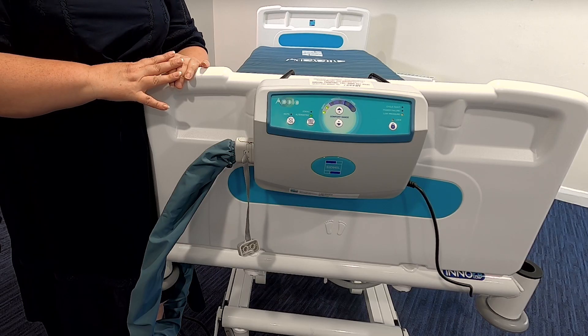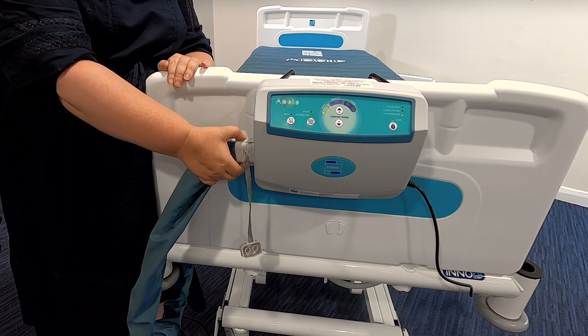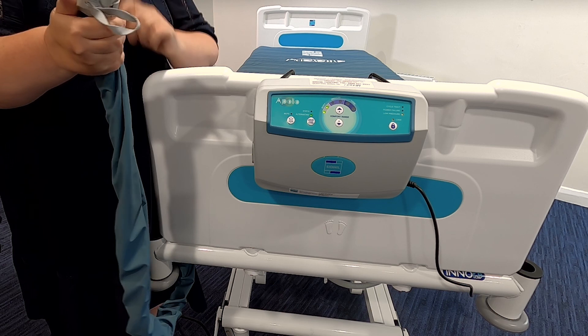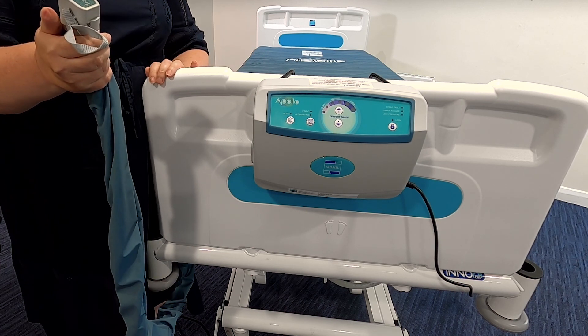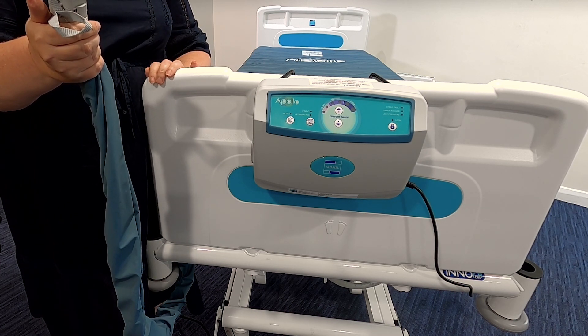In order to use the transport mode, switch modes from alternating to static and wait for all cells to inflate before transporting the patient. Remove the air connector from the control unit, seal with the transport cap, and turn off the control unit. The mattress will now stay inflated for up to 24 hours in normal conditions.